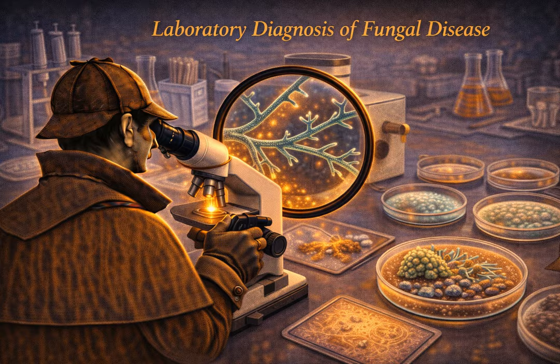There's no constriction where the tube meets the main cell. And other Candida species don't do this. Candida tropicalis or Candida glabrata generally do not form true germ tubes in that short time frame. So germ tube positive rapidly equals Candida albicans. It's a cheap, fast, 2-hour way to ID the most common suspect.